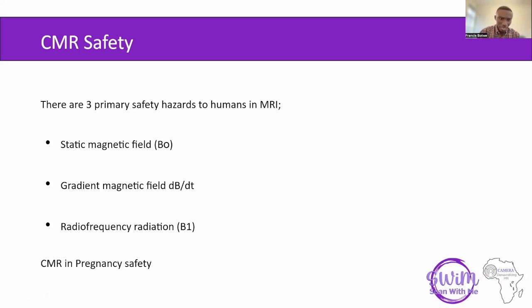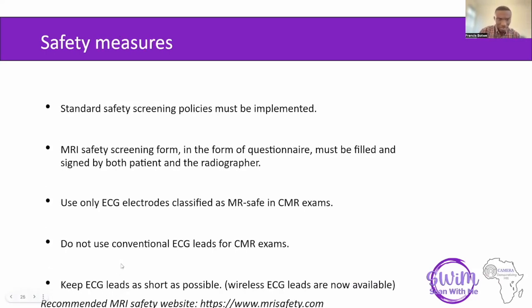Let's look at CMR in pregnancy. Is it safe to scan a pregnant woman? There is a lot of literature out there that suggests that it is safe to scan a pregnant woman. Before you do that, precautionary measures should be undertaken. You have to weigh the benefits to see whether it's very urgent for you to go ahead with the scan or not.